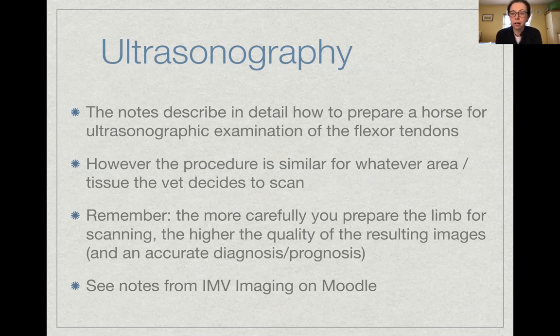also how to care for digital X-ray equipment and ultrasound machines to ensure that they last for a long time and you get the best possible quality images out of them. You will find in practice some people just never change the settings on the machine and you're ending up with very poor quality images. Whereas if you understand what the various controls do, you can really dramatically improve the quality of the images that you will obtain. And obviously the better the image, the better the chance you'll have of achieving a correct diagnosis for your patient. So really useful.